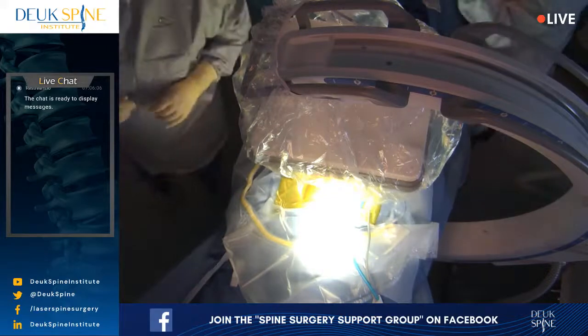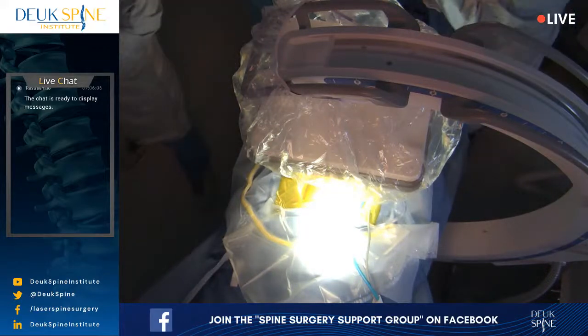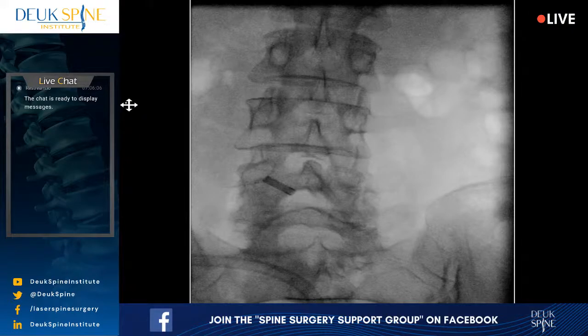All right, so we know that her back pain is coming from herniated disc at L4-5 and L5-S1 because, number one, her physical exam, that's where she pointed to. Her pain is the worst at L4-5 and L5-S1, around the belt line. Number two, we got the MRI, which shows herniated discs, which are slightly degenerated as well, so they'd be herniated, degenerated disc bulges at L4-5, L5-S1. So those are the two discs we're gonna target. We're gonna get started, okay?